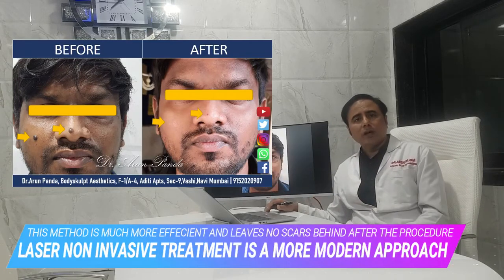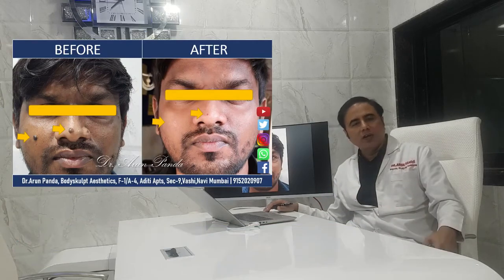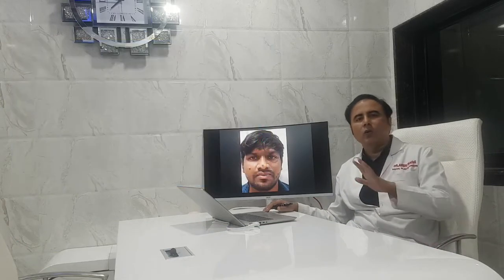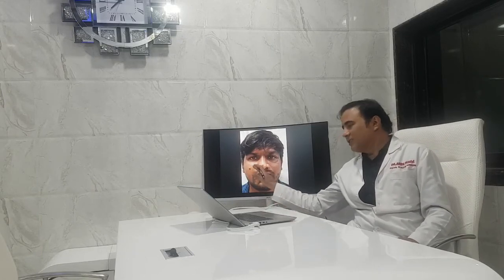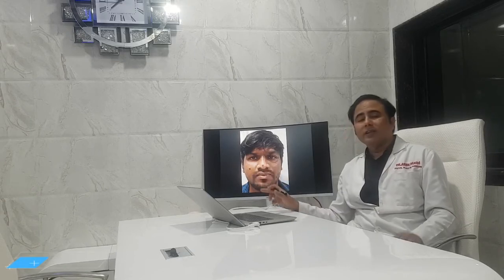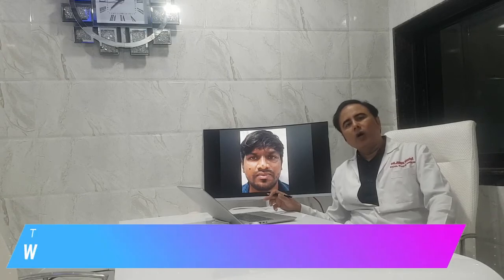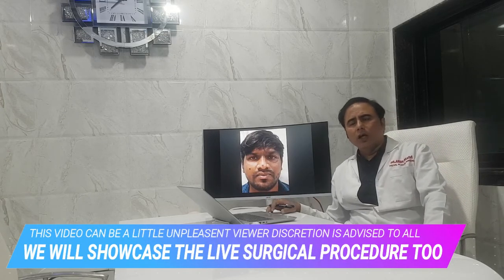There is a video which I am going to show now, which shows how we are using a radio frequency cautery to surgically scrape out moles for this particular patient. So he complains of multiple moles on his face. So this video demonstrates how we do radio frequency cauterization of the mole.